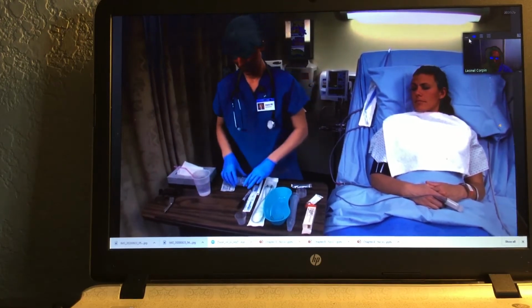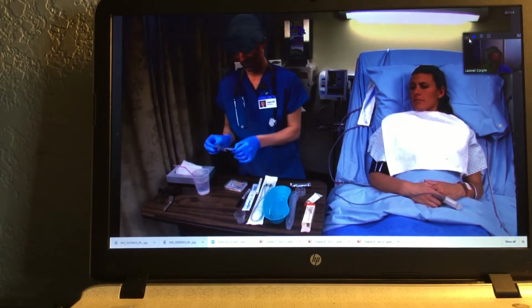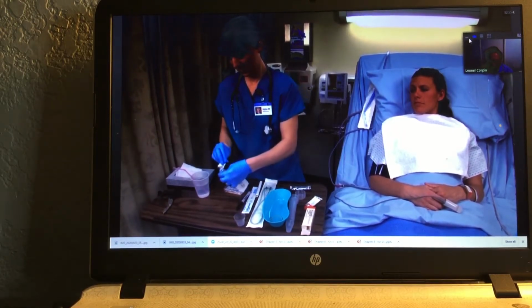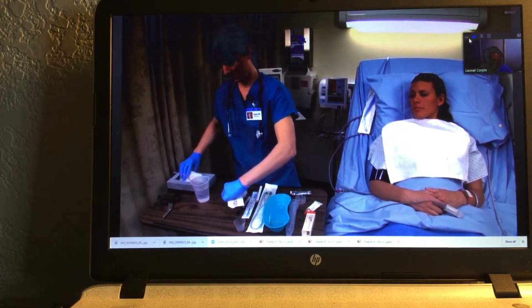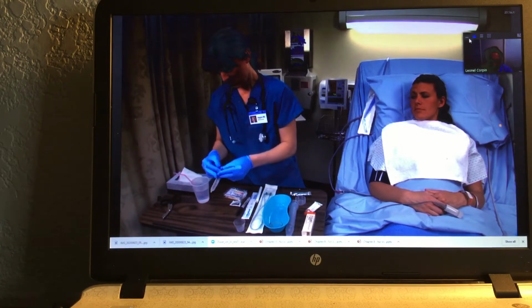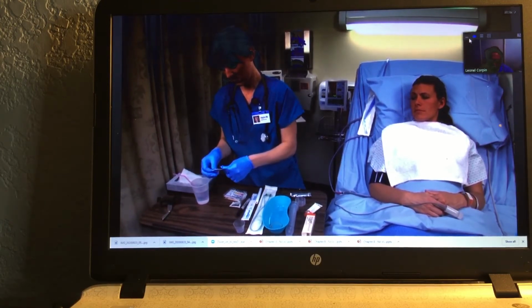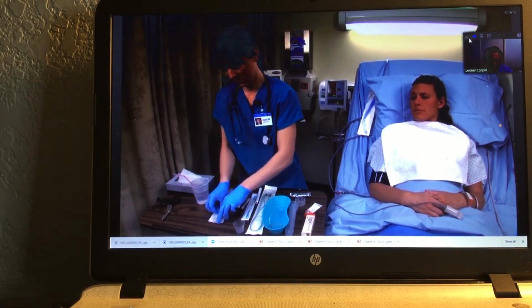You need a cup of water with a straw or ice chips for your client, pH reagent strips, an emesis basin, a tongue blade, a permanent marker, a cup of water to dip the lubricated tube in, and scissors. You need tape or an attachment device to secure the tube in place, skin adhesive, and water-soluble gels to lubricate the first 4 inches of the nasoenteric tube. You need a 60 milliliter or larger syringe to check tube placement and to flush the line. You need a tube fixation and anchoring device to secure the tubing. Open the tube's package and prepare the lubricants.